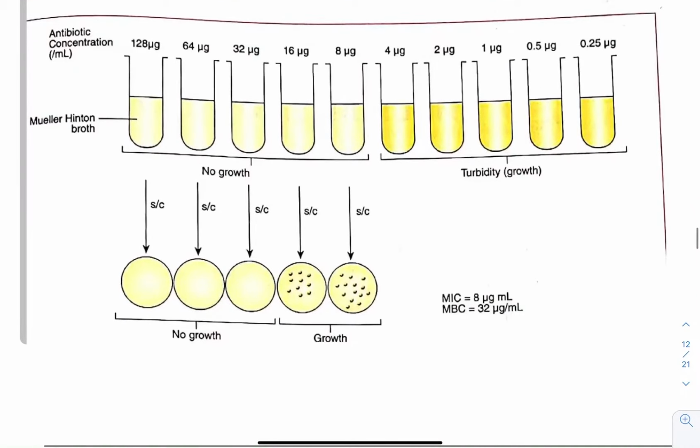Fine. What we have taken up are these test tubes in which there is a growth of the bacteria. Basically, you call it a bacterial inoculum, which you put into the Mueller Hinton broth. First thing, because of this growth, there was a turbidity in these particular test tubes, which was the same everywhere before.